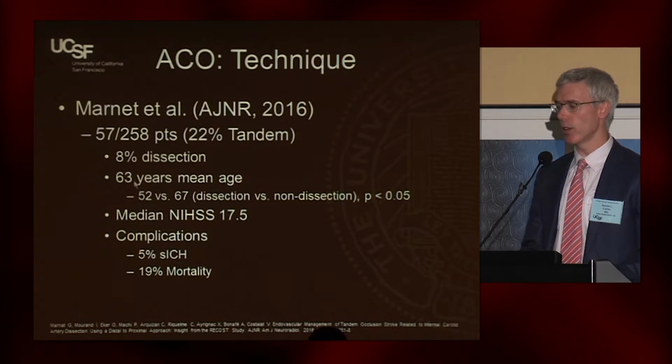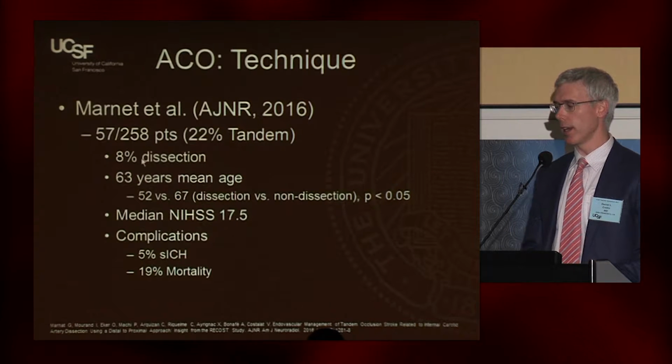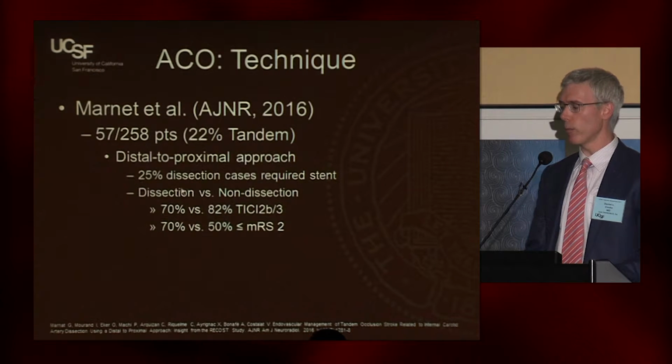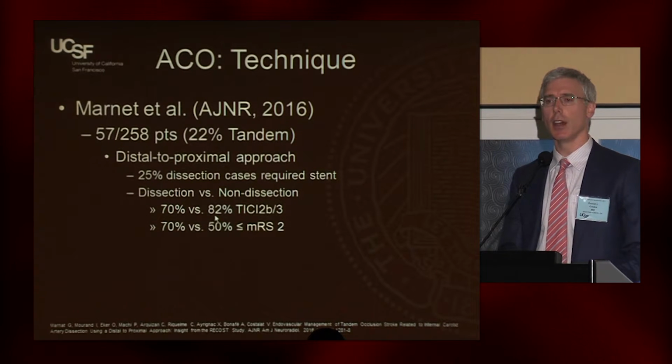But juxtapose that to another case series looking at the distal to proximal approach. Again, here's the baseline information. You can note there the relatively younger age of patients who had a dissection versus a non-dissection, and you can again see their numbers for presentation and complication rates.